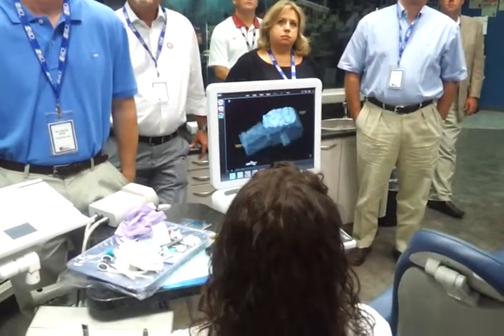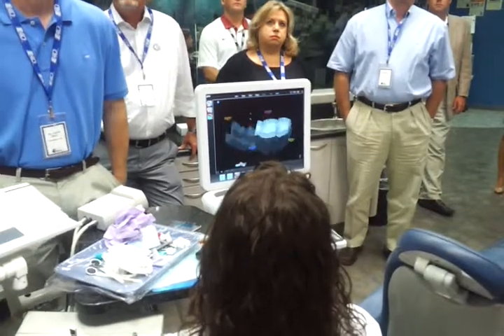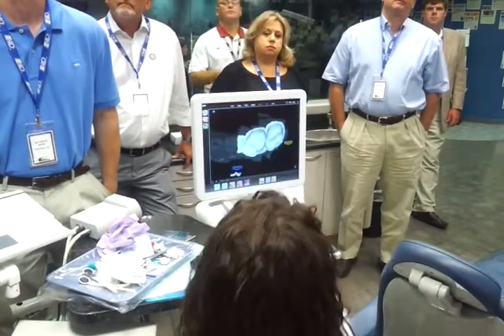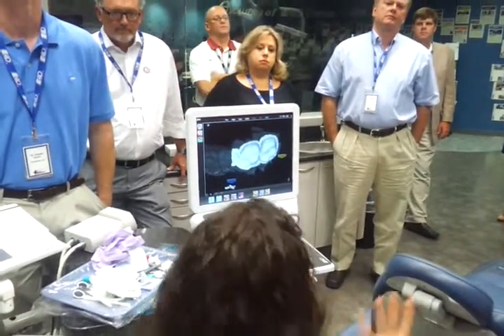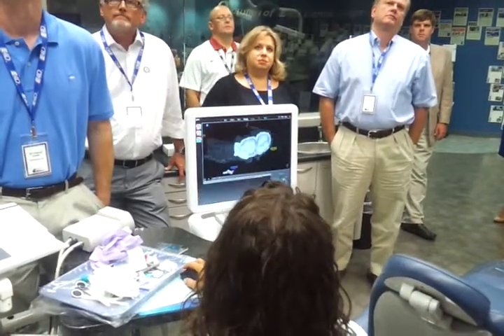Always rotating, lots of clicking and rotating. Just like when you get a lab case back from your lab technician, you don't just look at it from the occlusal and go, yeah, this looks great, it's going to fit. No, you rotate, you take a look at it from all angles.